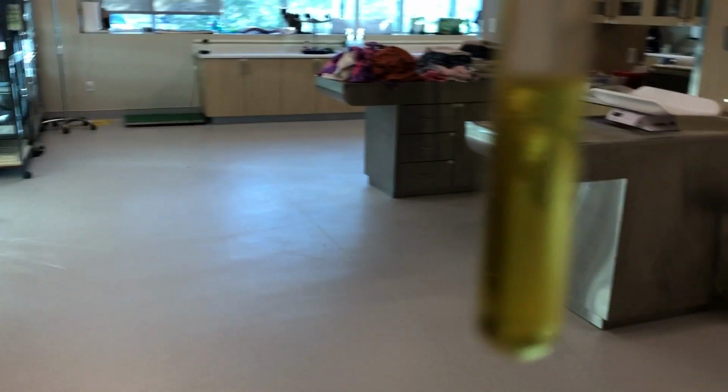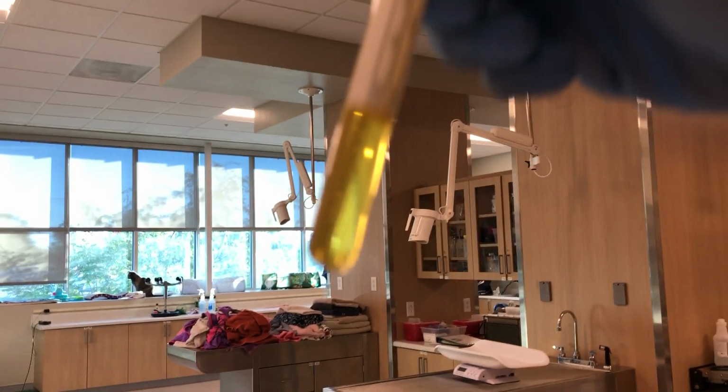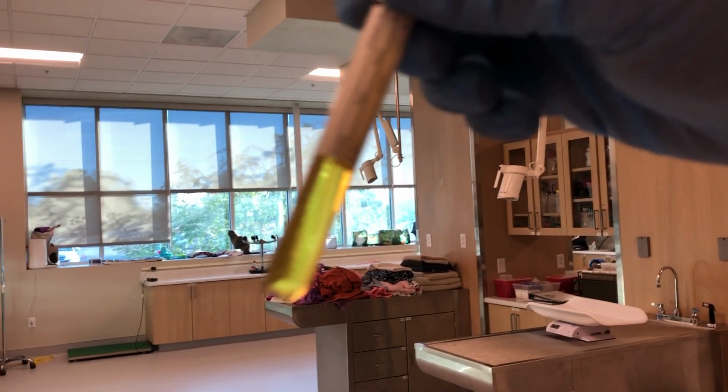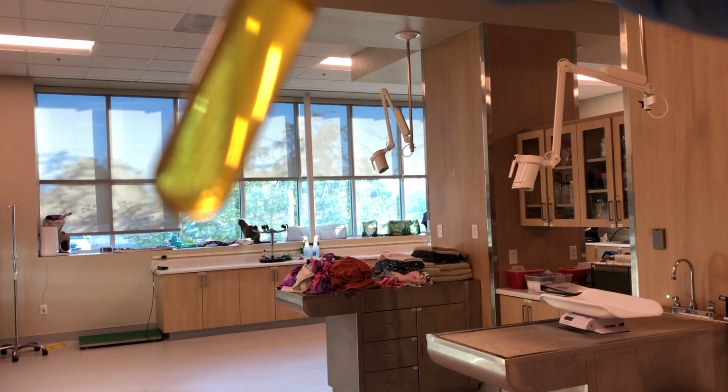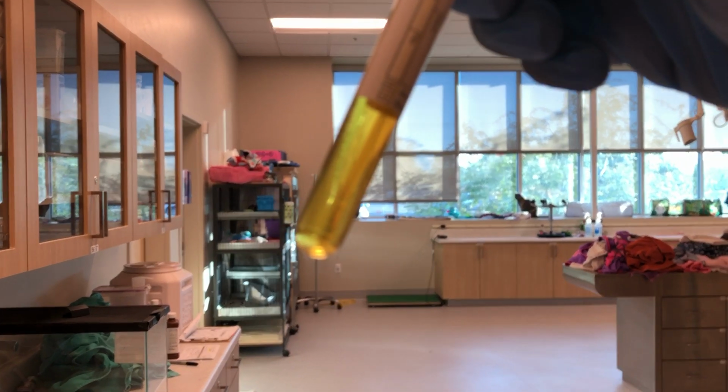So the sample tube has been spun, and you may or may not see a visible sediment or pellet at the bottom of the tube, but there is always some sediment there. So don't be discouraged if you don't see anything. There will be something for you to look at under the microscope in most cases.